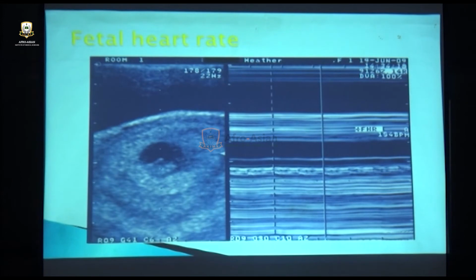डॉक्टर साहबान यहाँ बैठे हैं, इन्होंने आपको बताया डॉपलर में क्या क्या होता है, क्या क्या देखना है, सब कुछ नजर आ रहा होता है. But that's a different topic. I don't want to go into that. What I am trying to tell you is the basics.